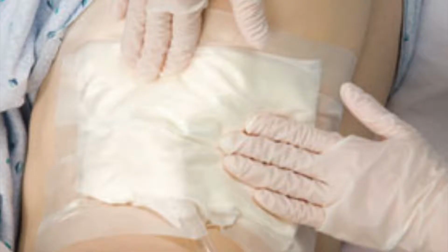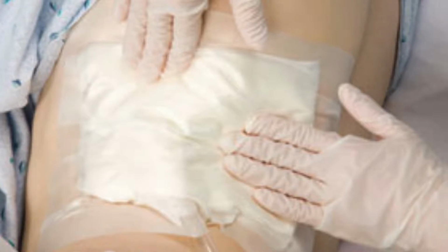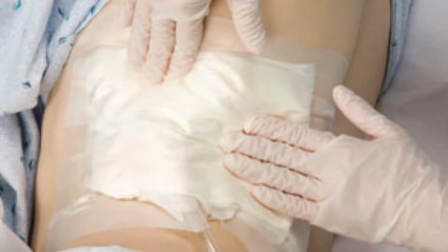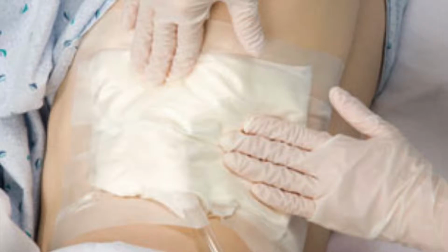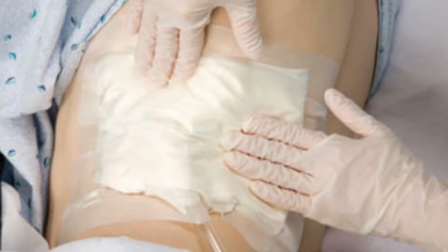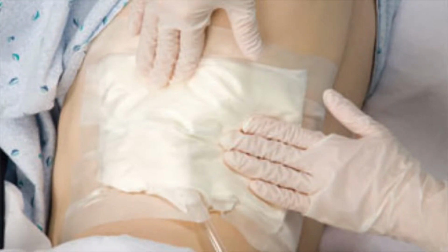The second thing is preparation. You will first need to check the provider's order and verify that it is complete, and if necessary, check with the provider. You will then need to verify the consent with the patient, as the procedure should have already been explained to the patient by the provider, and then you will gather your supplies.